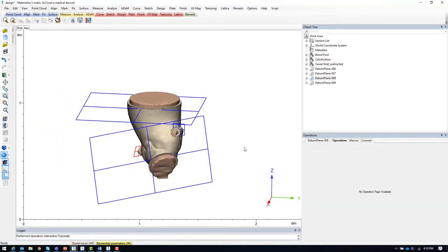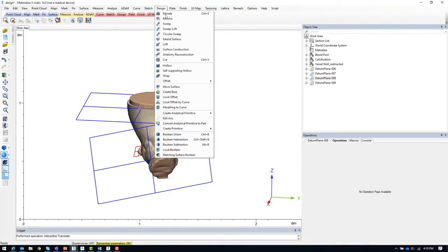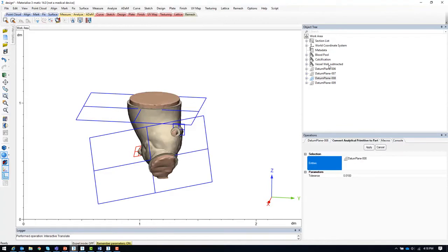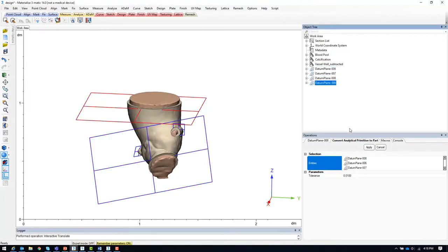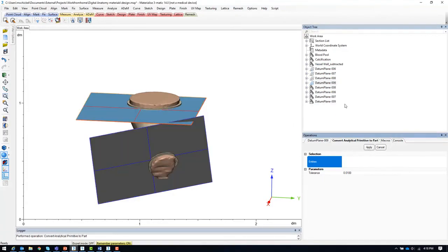Finally, we need to convert the datum planes to surface files because the analytical primitive datum planes that we are working with right now are treated as infinite planes when cutting. So we will select each of the datum planes and convert to parts.